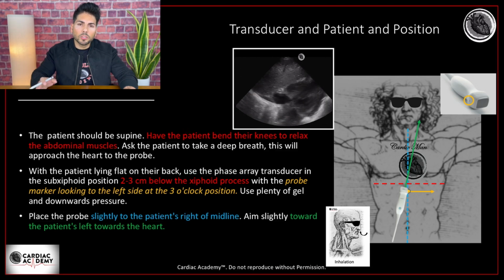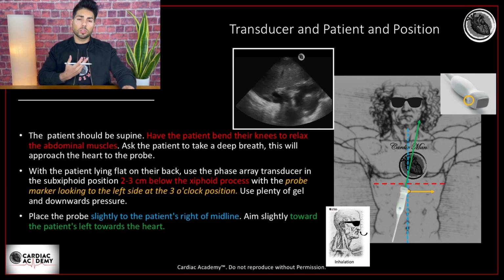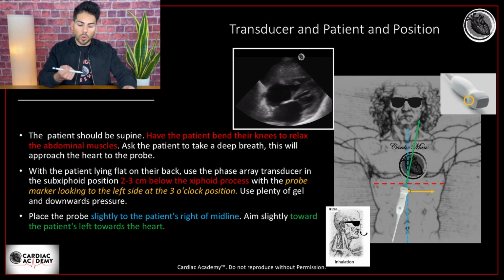So have your patient supine, ask them to bend their knees, and you can also ask them to take a deep breath. Remember that when you take a deep breath, your diaphragm will go down, which brings your heart closer to the probe, okay?